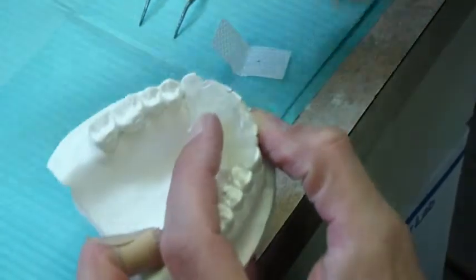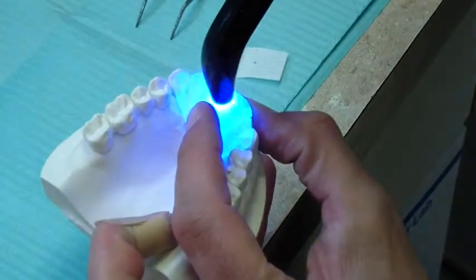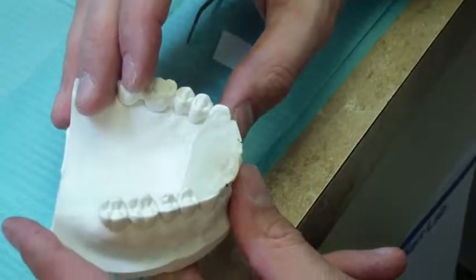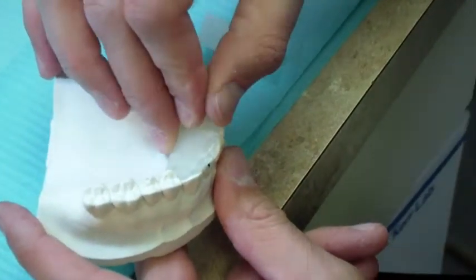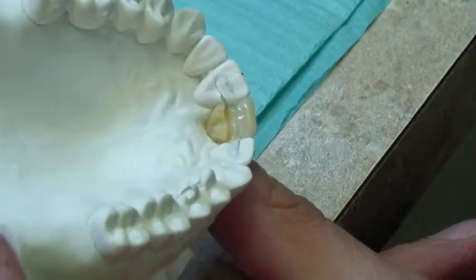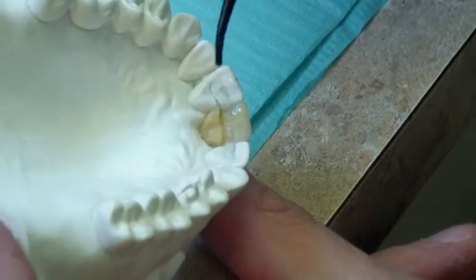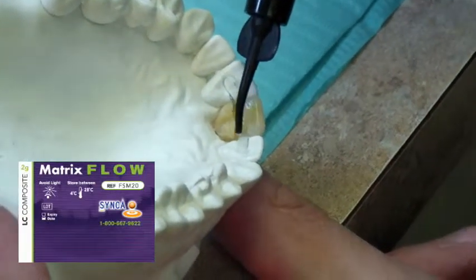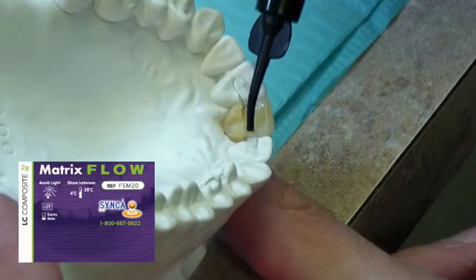Light cure through the index from the lingual side for 30 to 60 seconds. When light curing is complete, remove the index. At this stage, the flow resin is used to fill any voids in the lingual side of the space maintainer and to cover the fiber wings on the abutments.